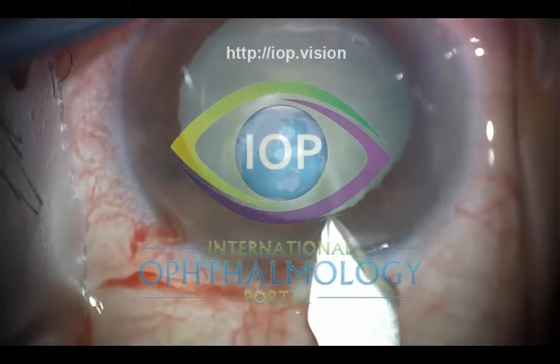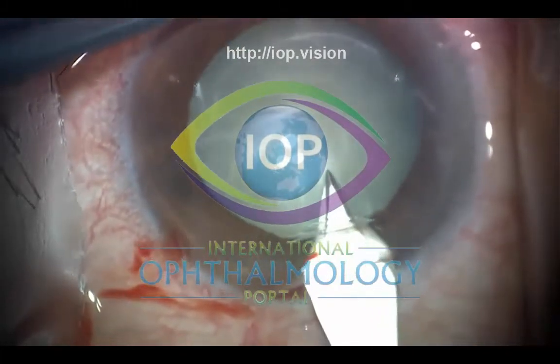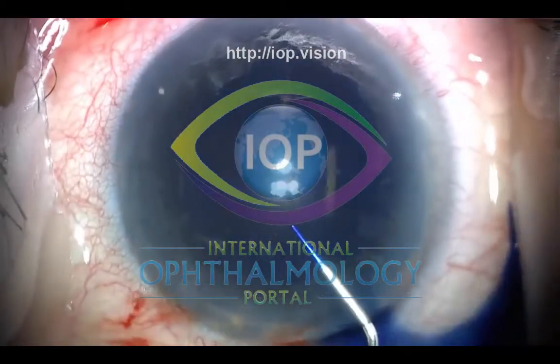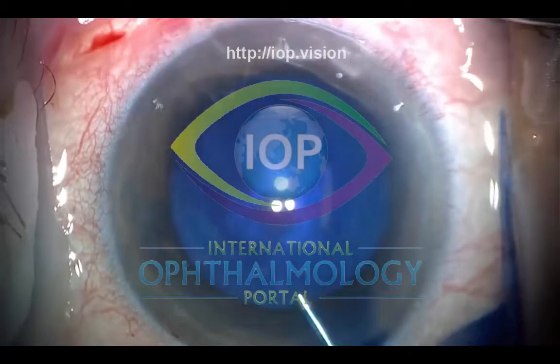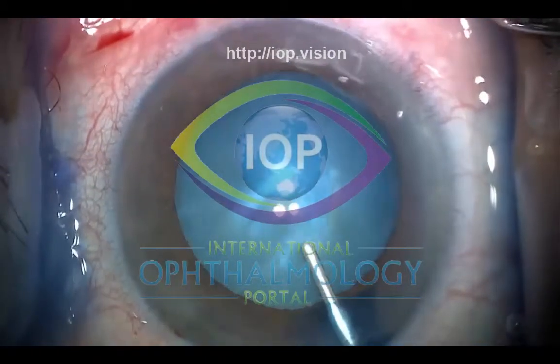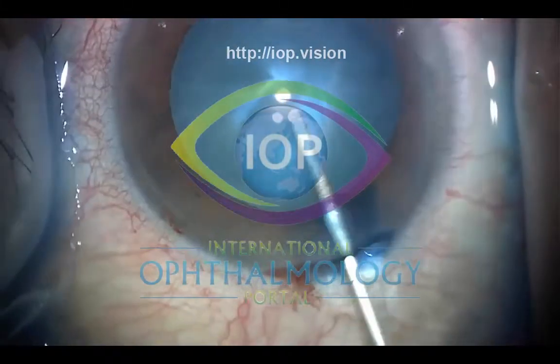You can see that we're making our incisions into the eye, and because this is an angle closure eye, the keratome incision is slightly longer. I'm using vision blue here to stain the anterior capsule, injecting it directly into the anterior chamber. Then we use some Helon GV to really flatten the anterior capsule.